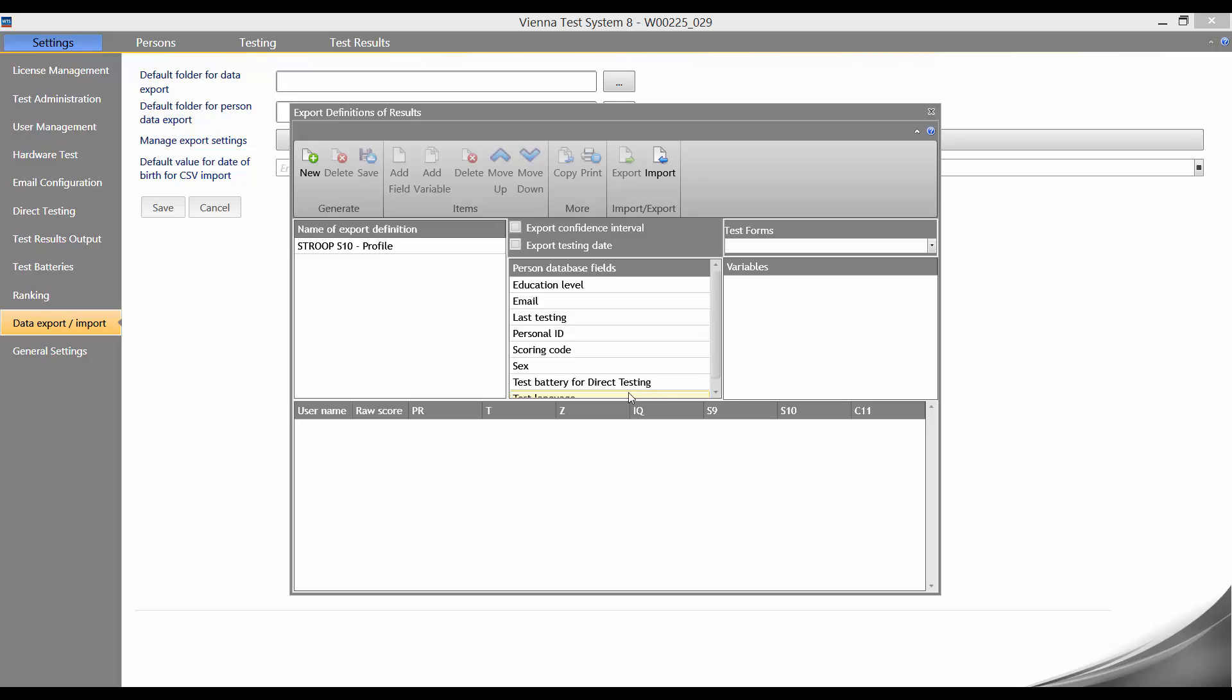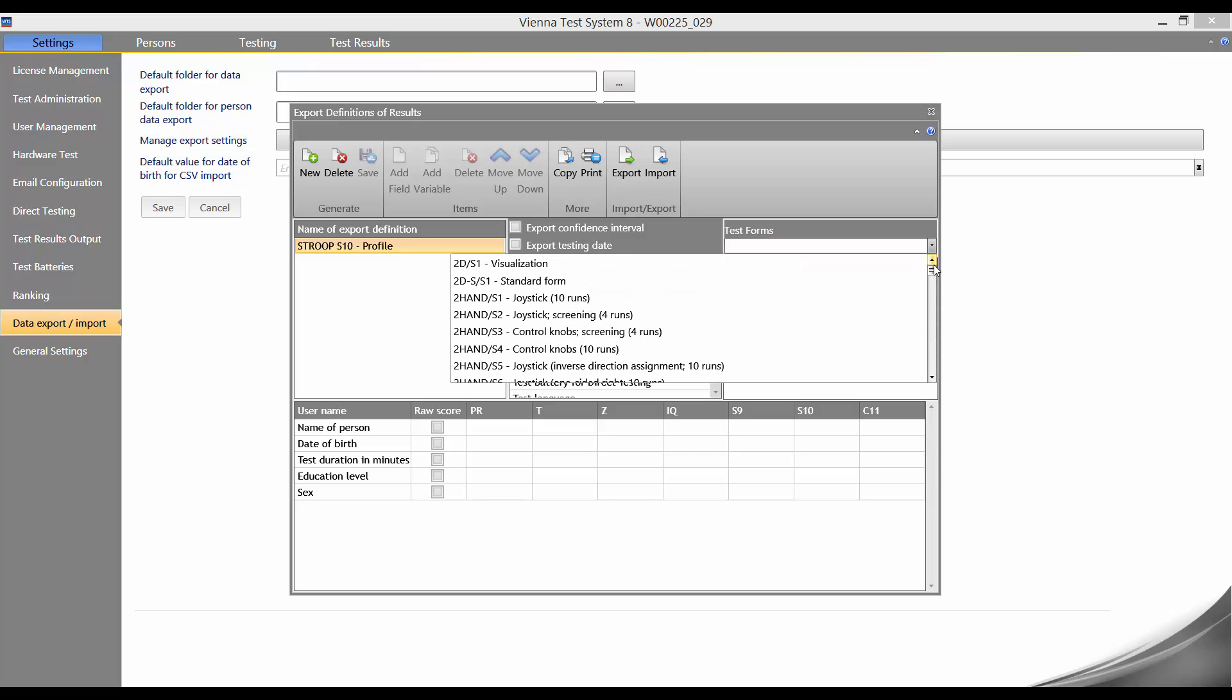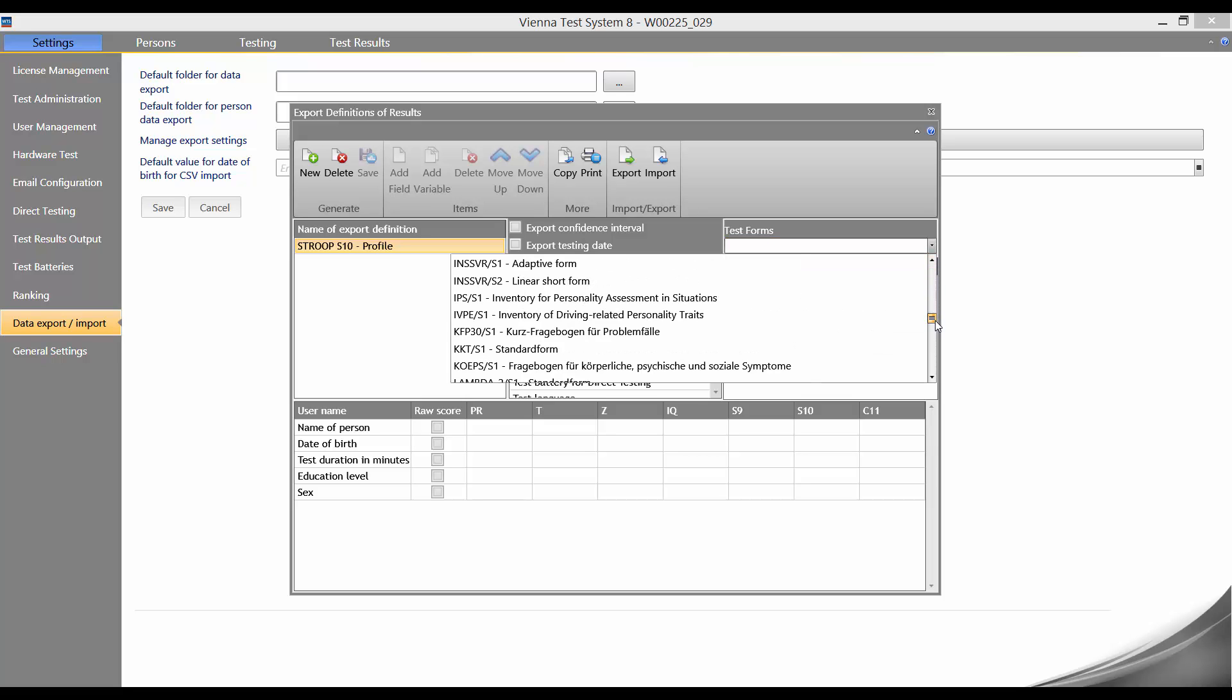We now click on our profile here in the left-hand column to edit it and add test variables. Under test forms, we can select Stroop S10.